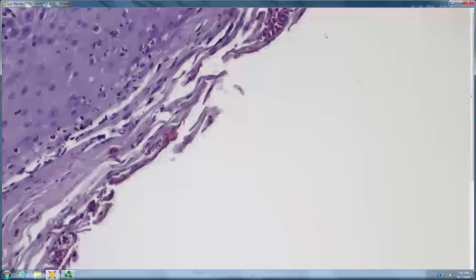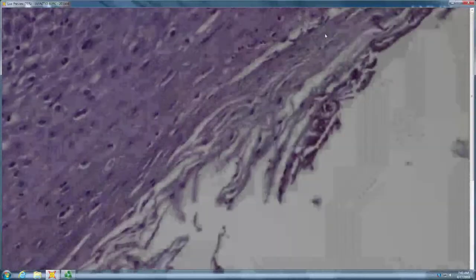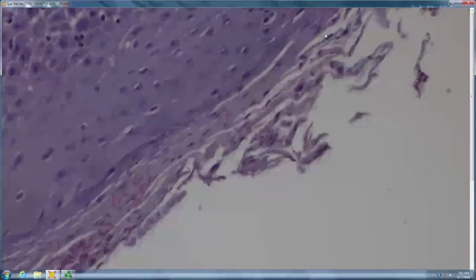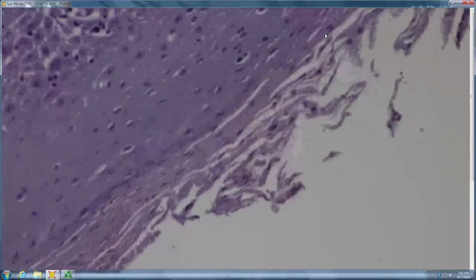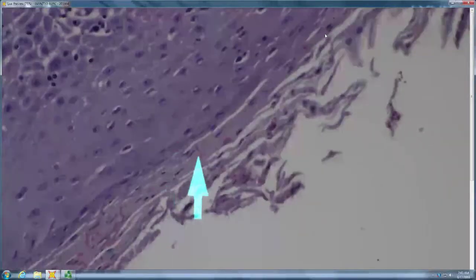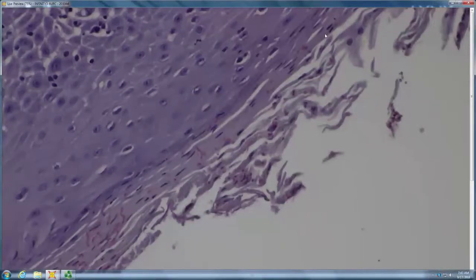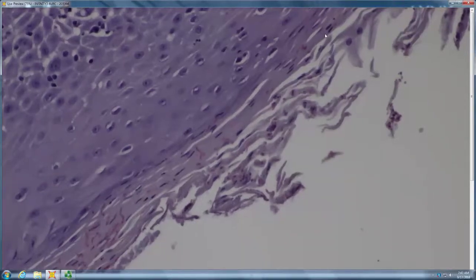Okay. So you get a stain. We have some fungus in the stratum corneum. And what direction? Vertically oriented. So more likely tinea, or Candida? Tinea swims, Candida dives.